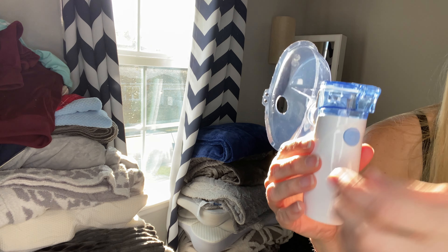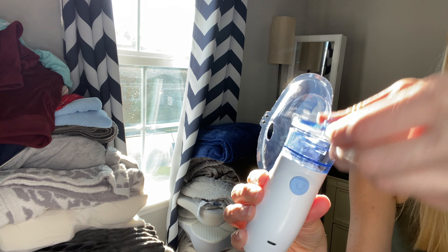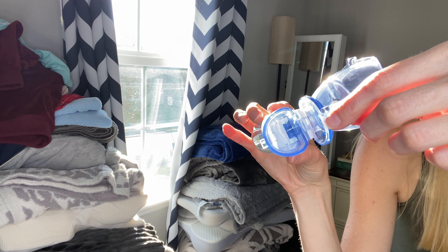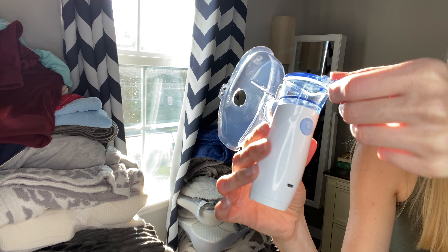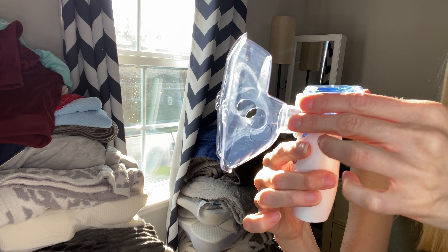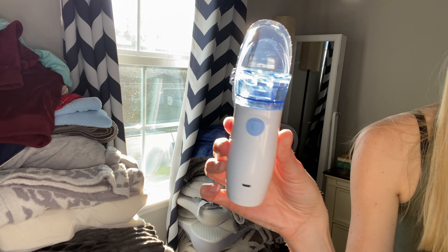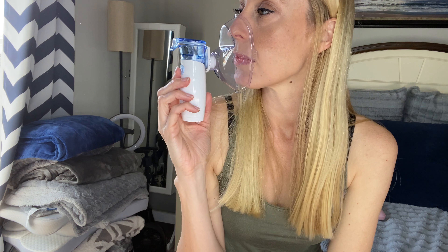It is extremely quiet. The machine is for adults and kids — a gentle mist sound will go, but that's about it. It's portable, so you can easily take it with you. It does have a self-cleaning mode, so it's pretty easy to clean and keep clean. It has an automatic shutdown, it's lightweight, so you can take it with you if you're going to be out of town. And there are also two different modes that you can use to adjust the nebulizer.